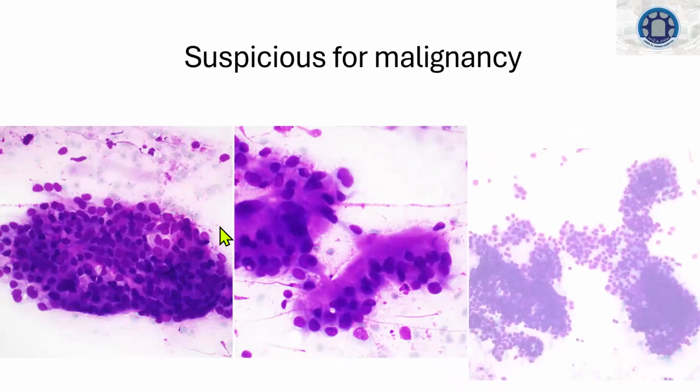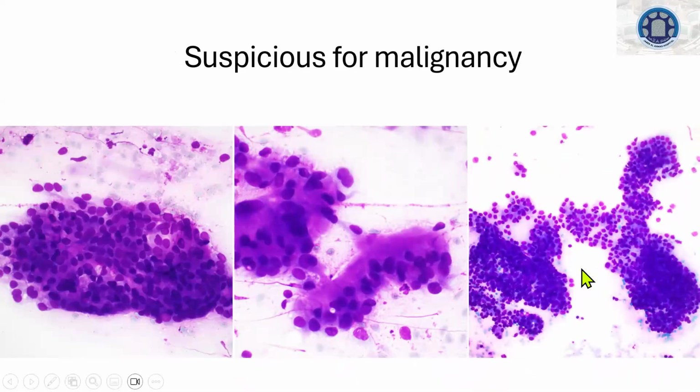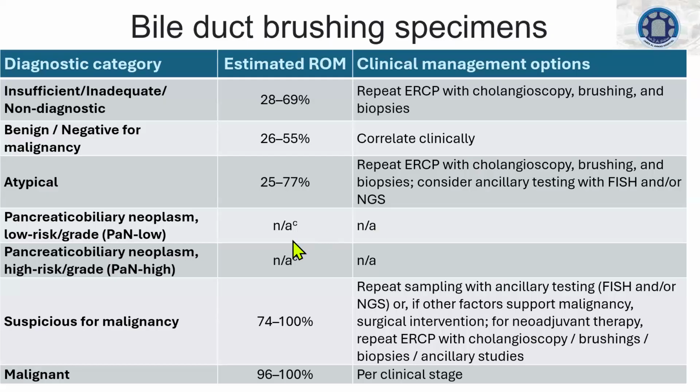very less. Again, you are getting an aspirate like this, only this cluster of cells are there, and you are seeing these kind of abnormal looking nuclei. This came out to be signet ring cell carcinoma later on. So it is when the cellularity is very less, or you don't have enough material to do a cell block later on, then you give it as suspicious for malignancy.